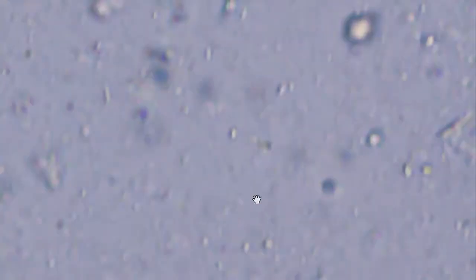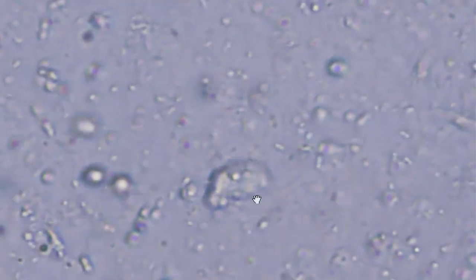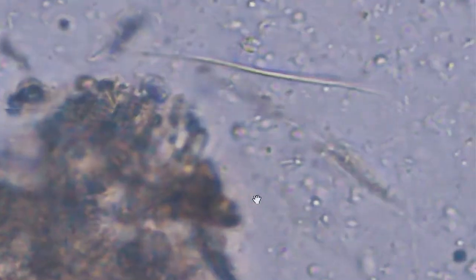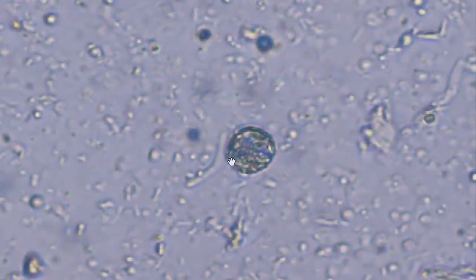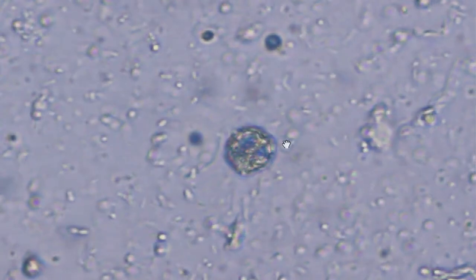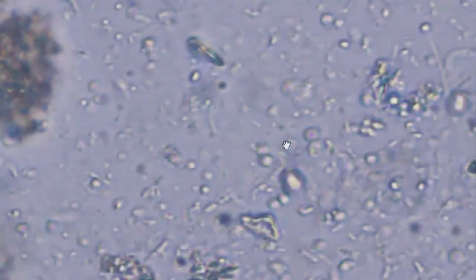This is in a saline wet prep here. Keep scanning. Let's see what else we can find. You can see there's a lot of fecal matter in here, bits and pieces of fecal matter. This is not an Entamoeba because it does not have a perfectly defined cyst wall. We'll keep scanning.